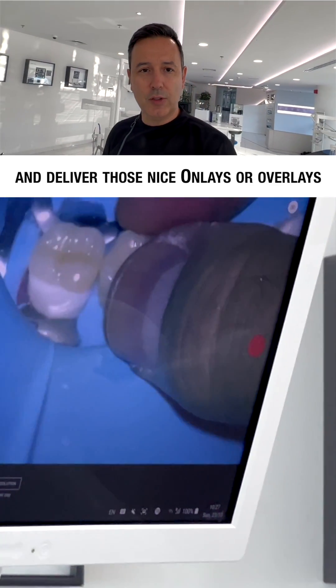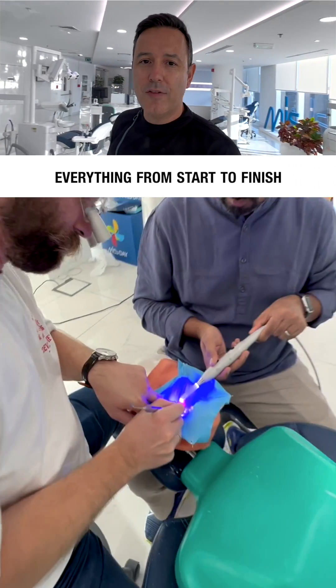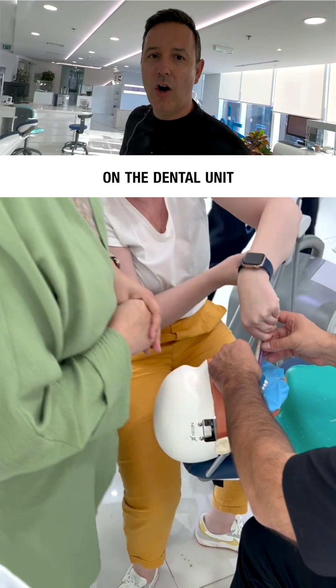Then we move back to the chairs and deliver those nice inlays and overlays with heated composite under absolute isolation. In other words, everything from start to finish, done by yourself on the dental unit.